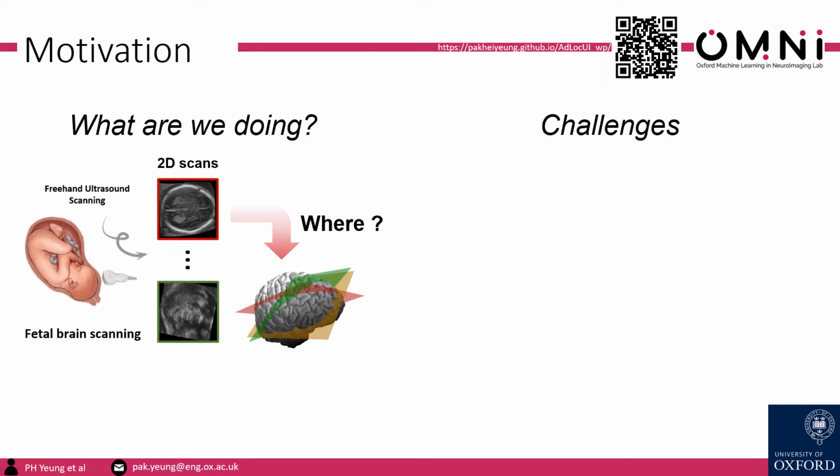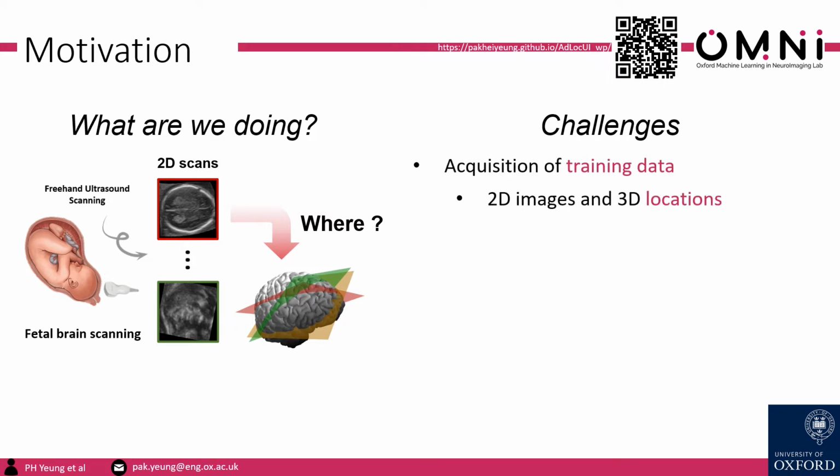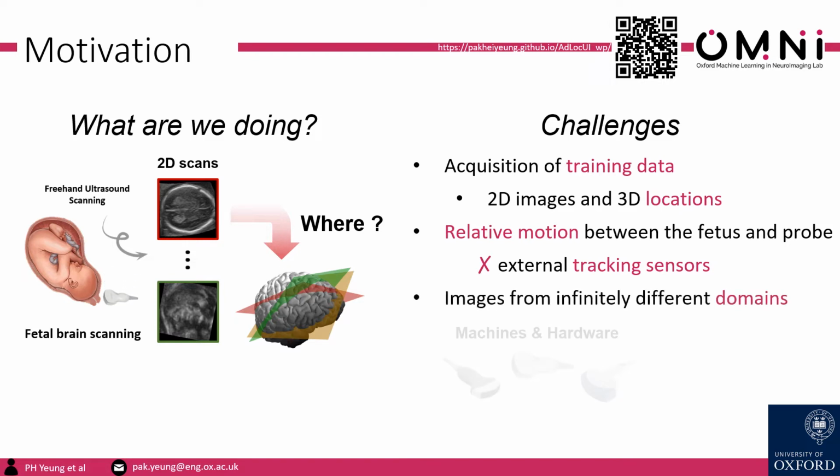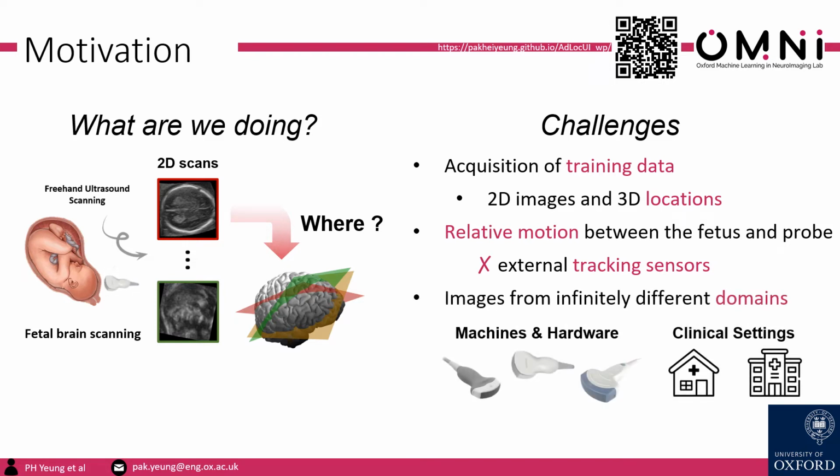Nevertheless, several challenges are involved. First, acquiring training data locations is difficult. Also, unlike many prior ultrasound navigation studies, external tracking sensors may not be used because the fetus will move inside the womb during scanning. Furthermore, in practice, images can be from infinitely many different domains.